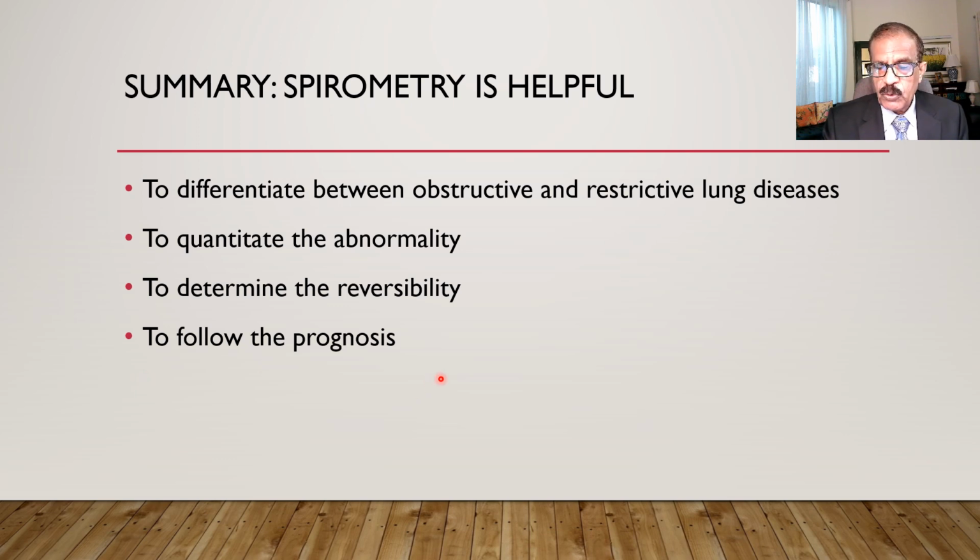To follow the prognosis, whatever treatment we are giving, we want to know if the patient is improving. Of course, the patient's symptoms will also guide us, but to be more objective and more precise, we have to measure the pulmonary function test, and we can see how much the improvement is. If there is no improvement, we can maybe try harder with other agents, and if the patient is improving and facing side effects, then maybe we can step down. And if you're studying experimental medicine, then these pulmonary function tests are also very useful.